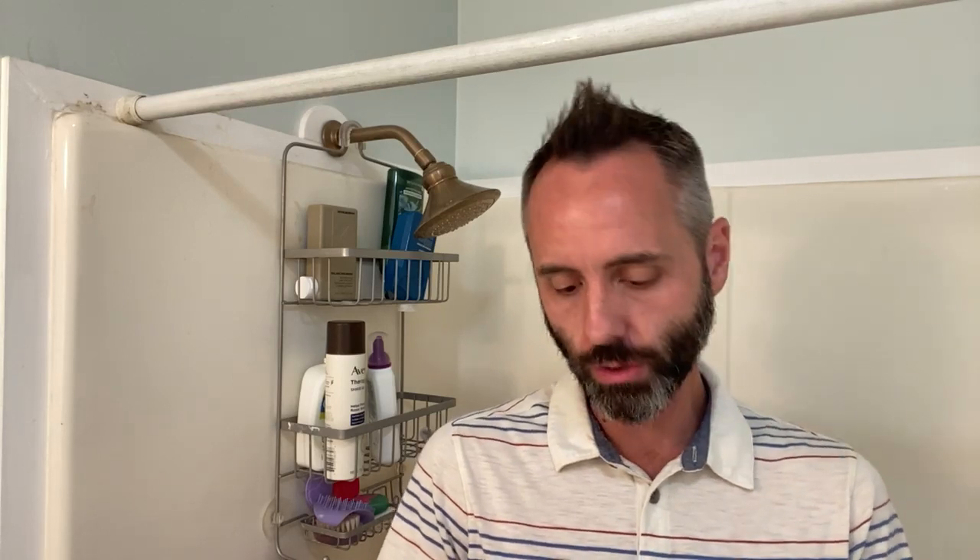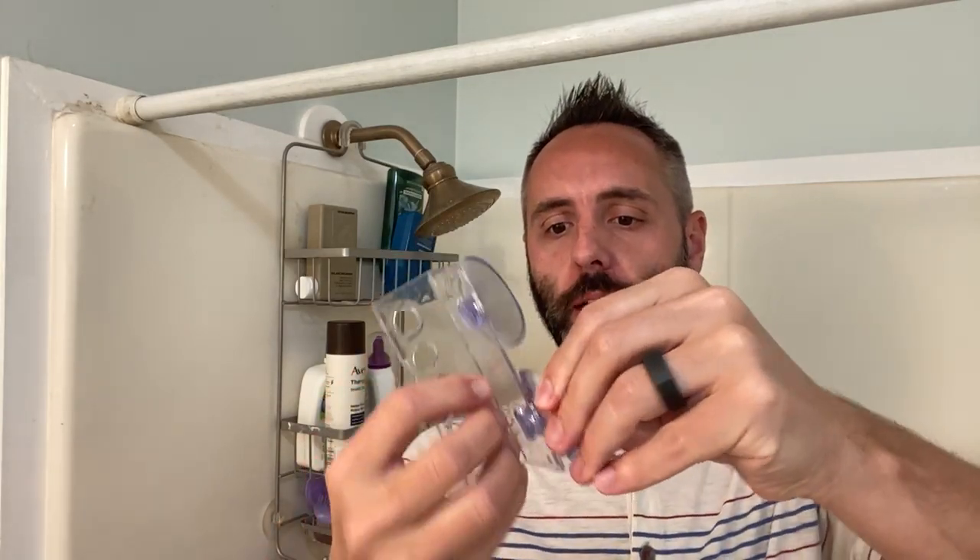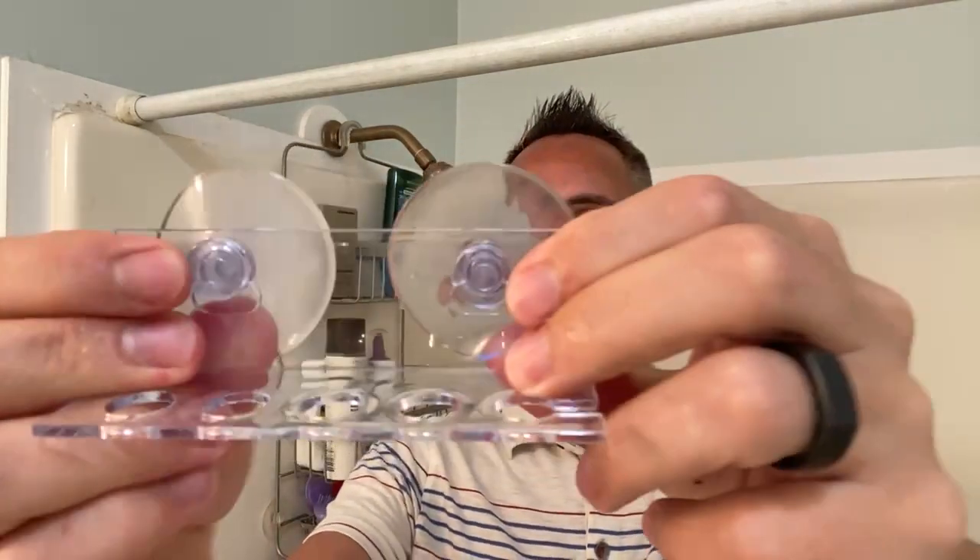This works extremely well for my daughter because she has braces, and it's really hard to get all the food stuck in there with just a toothbrush or one of those aggravating pick things. So we decided this would be a good supplement — while she's in the shower she can floss as well. My son too has been having some teeth issues, so better flossing would be good.